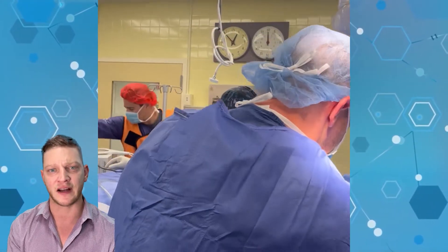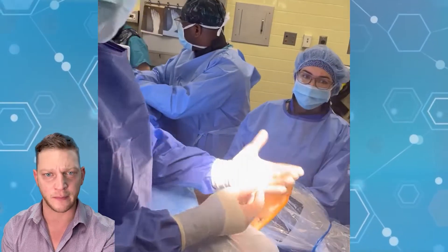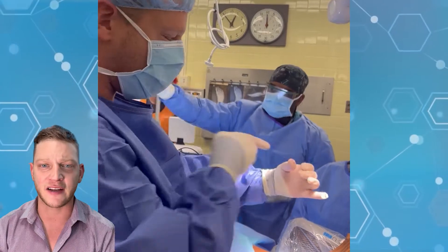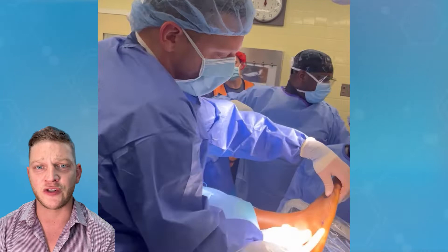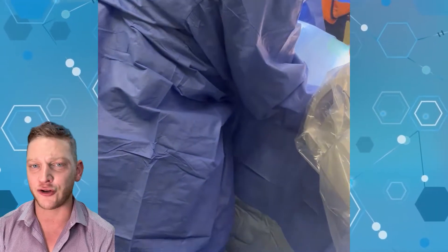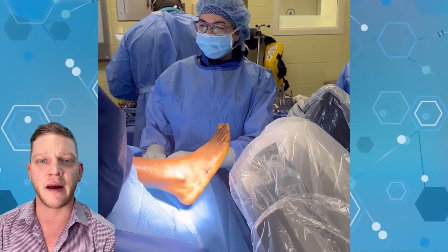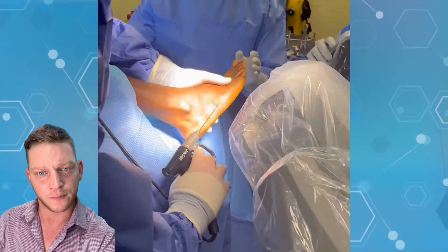They do this with different techniques — one being the lag technique, which we'll go into in a bit. I haven't asked this podiatry student for permission to put her on here, but I'll ask her anyway. These podiatry students are here to learn as much as they possibly can. You can see she's wearing lead around her neck, chest, and waist — protected from all the x-rays being taken. We wrap the patient's waist with lead as well to limit the amount of radiation exposure and any future problems.